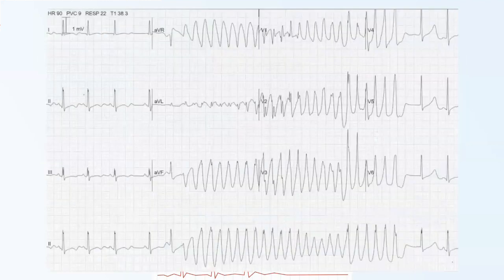If you look here, this is just a 12-lead showing you a normal sinus rhythm, and then here you've got your torsade, with much more increased amplitude QRS going back to low, going back up, and then it's self-limiting and it goes back into sinus rhythm there.